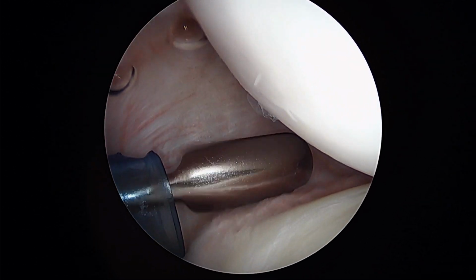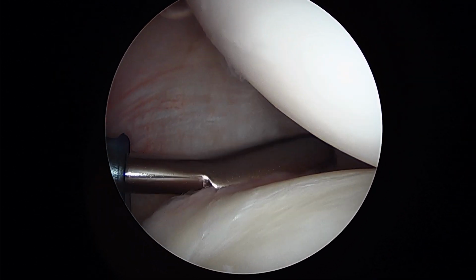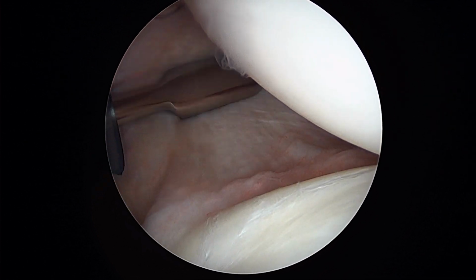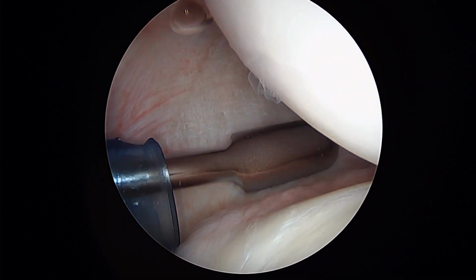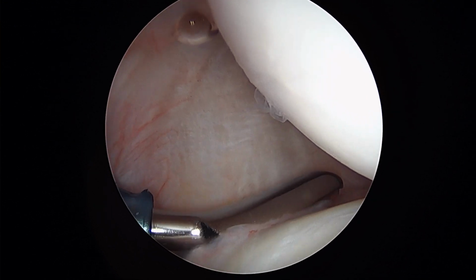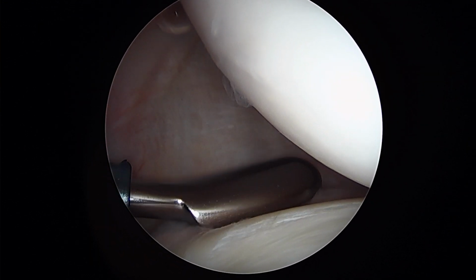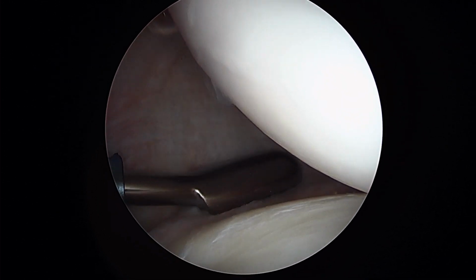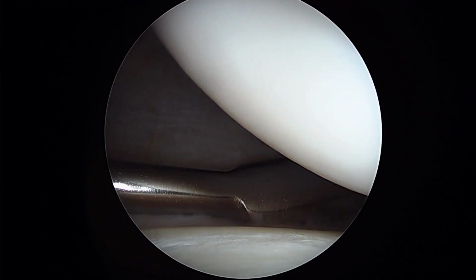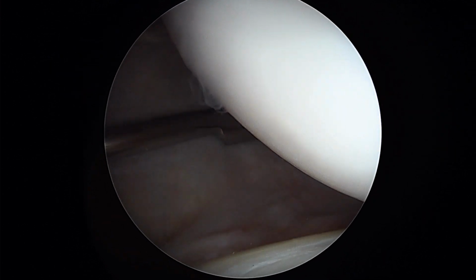This is a rasp, and we're going to use this just to roughen up the capsule a little bit. We're not trying to really take away any tissue. We're just trying to create a healing response and basically make this like Velcro so it gets sticky and sticks together. The next step is going to be to use a spinal needle to plan our angle for our posterior suture anchor, which is the one I like to place first here. You can see with the rasp, we can go all the way through the inferior recess like that.